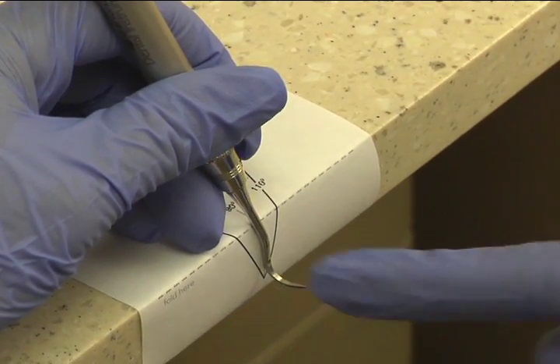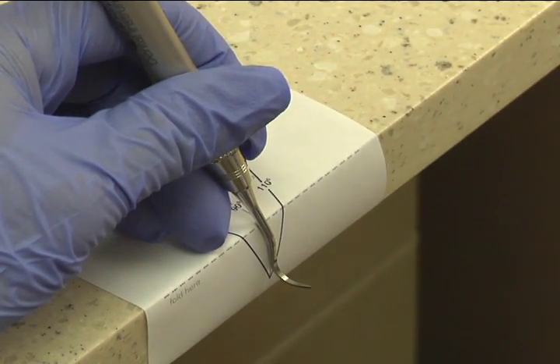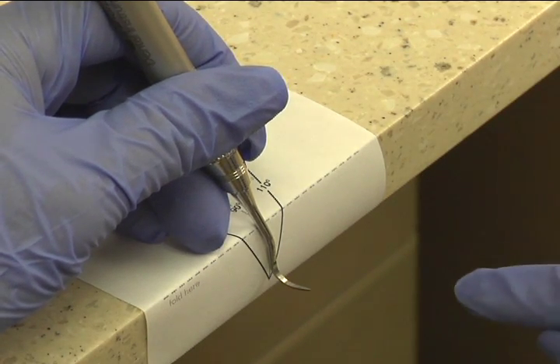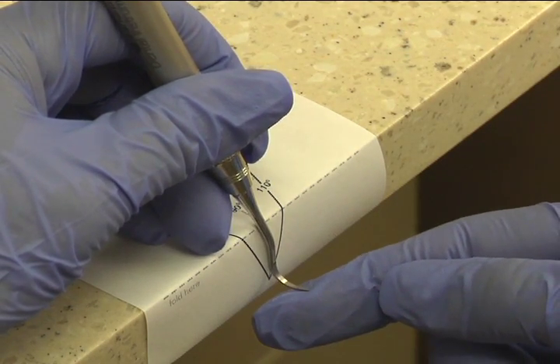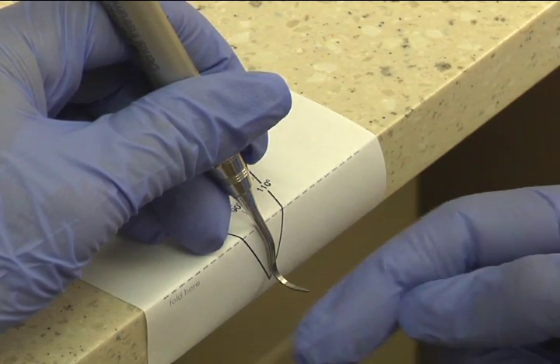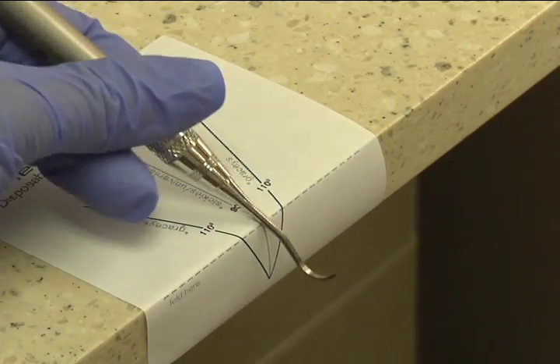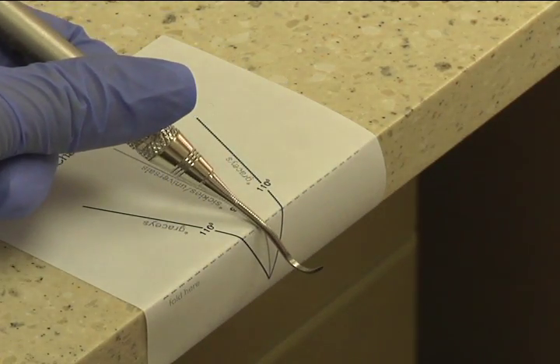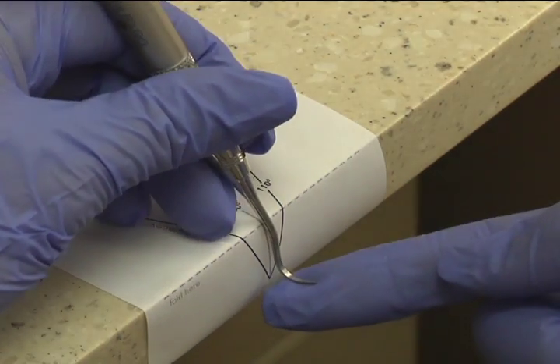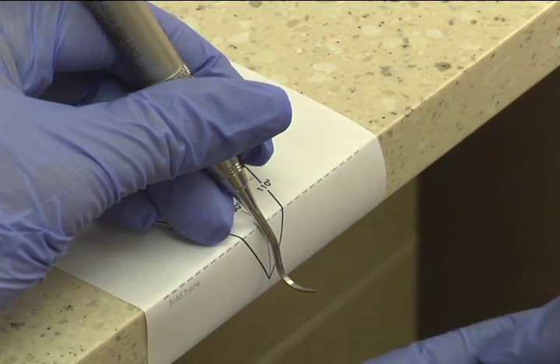And I usually try to keep the blade right at the V of the guide. Now, if you don't have a guide, you can make up your own guide. It's easy to do. So you just have your terminal shank at the 90. The toe is toward me. And the reason why I say that is because some people tend to move the instrument up like this and it's pointing up. So you don't want to do that. You want to keep it towards you. And then the face is automatically parallel to the ground as well.